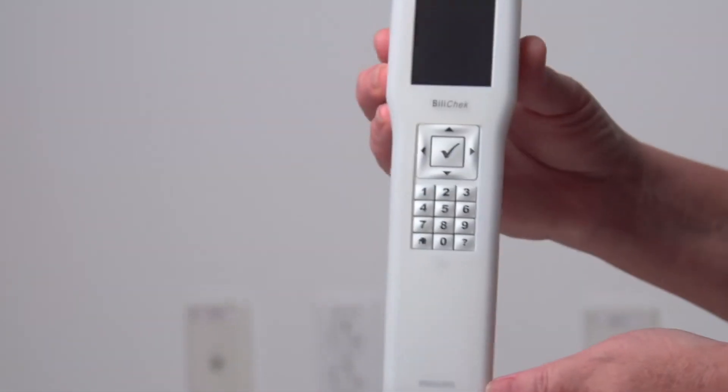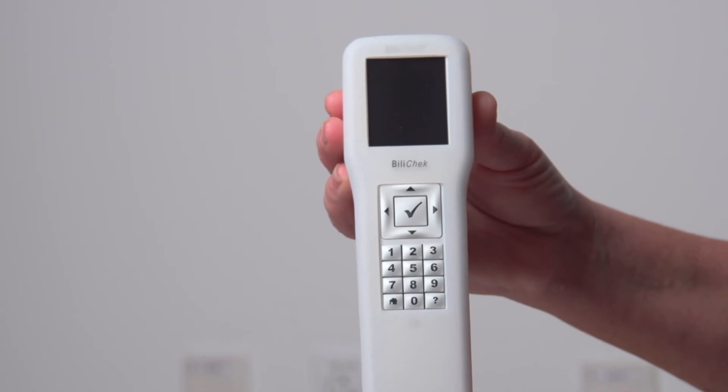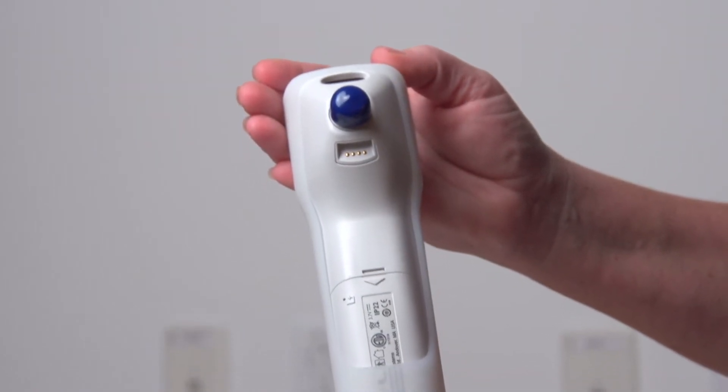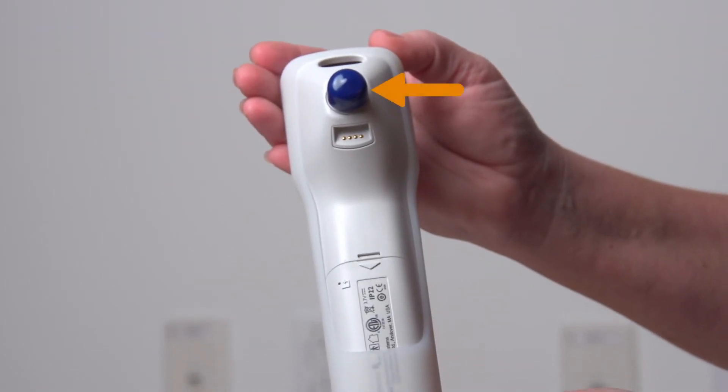Now let's take a closer look at the handheld unit. It consists of the display window and the keypad. On the back is the calibration tip, the barcode scanner, the battery compartment, and the charging pins.